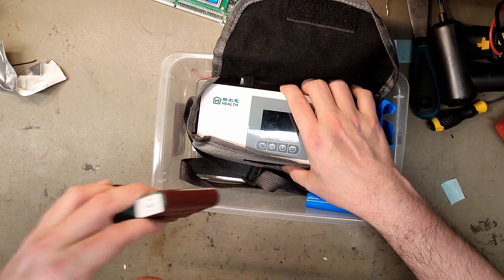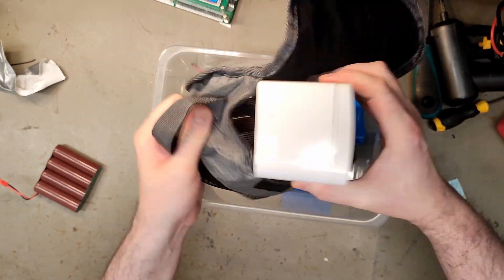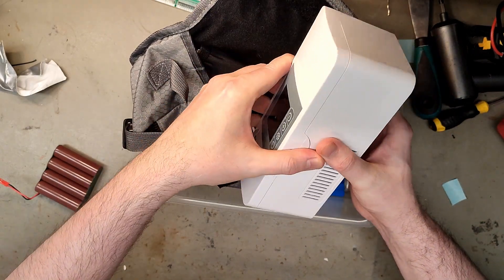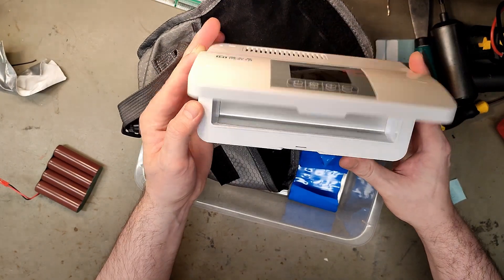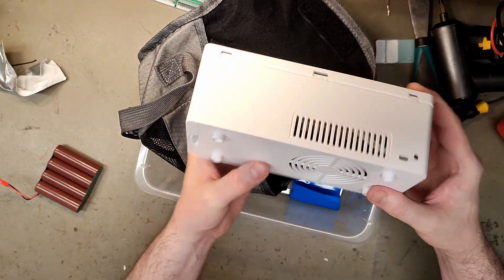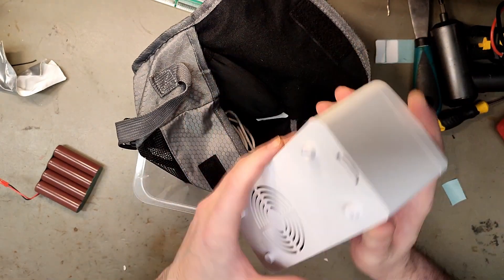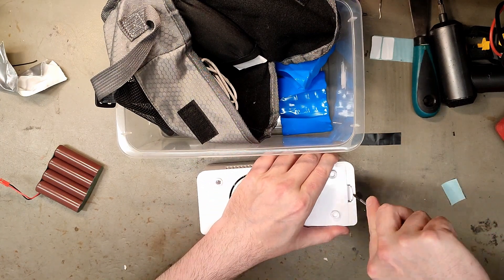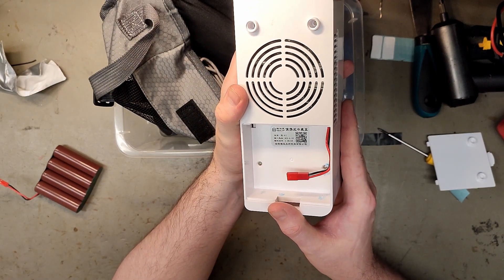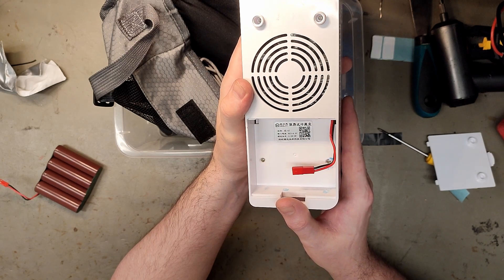Today we're looking at a refrigerator that doesn't appear to be a certified medical product — more likely an AliExpress find for a beer can or medicine. It has no real information except 'health' and something in Chinese, and no label. Strangely there's a battery compartment, but it doesn't run on alkaline batteries. There is actually a label: Health HLA1, DC 5 to 6.5 volt, 3.5 watts, and a QR code.